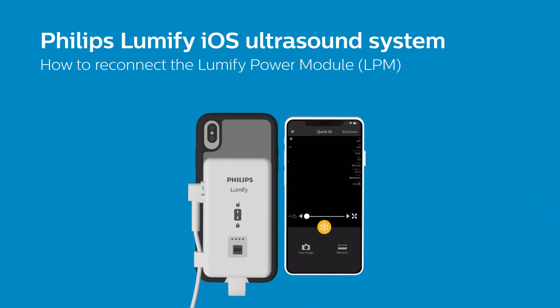In this video, we will show you how to reconnect your Lumify Power Module if its connection to your iOS device has timed out. The easiest way to determine if your Lumify Power Module, or LPM for short, is disconnected from your iOS device is by hitting the Unfreeze button in the Lumify app and receiving this message.